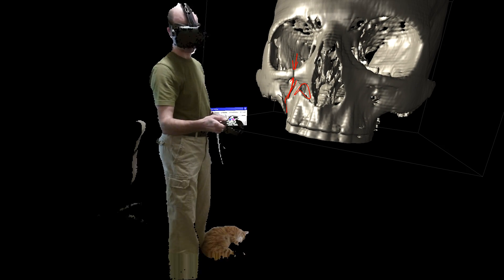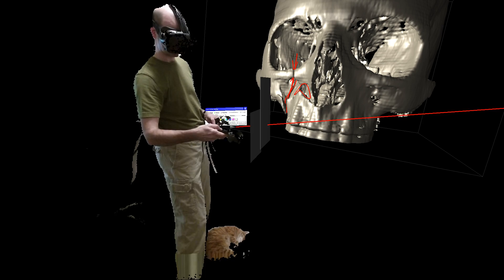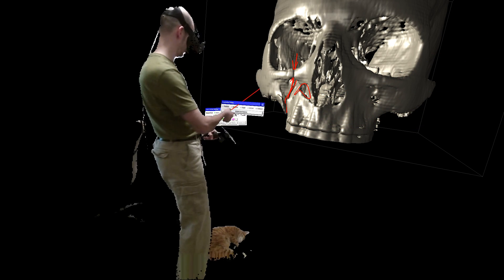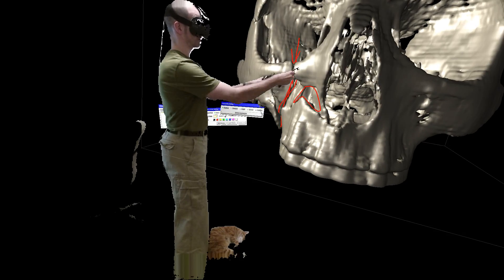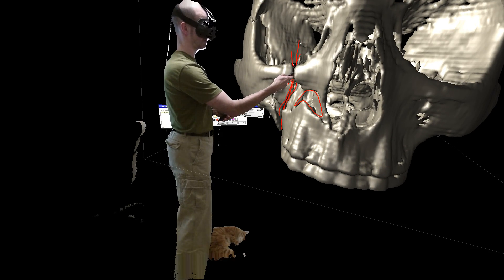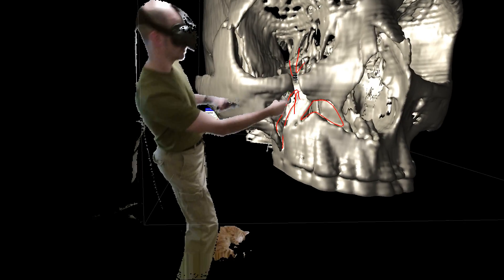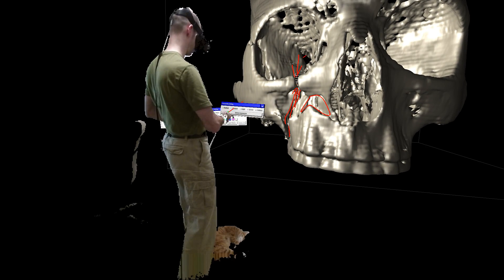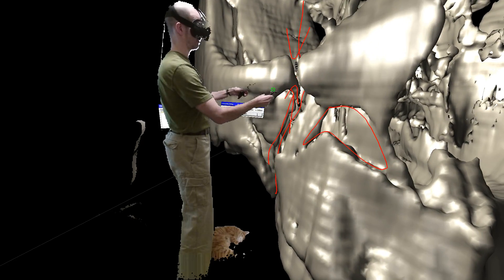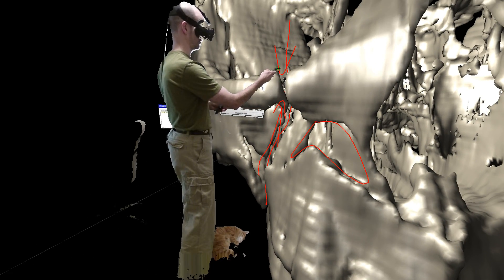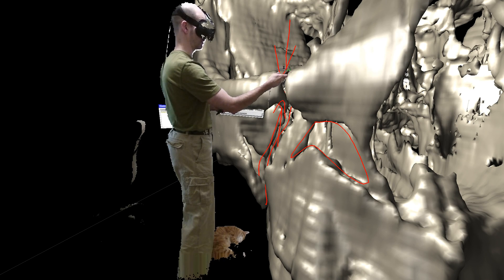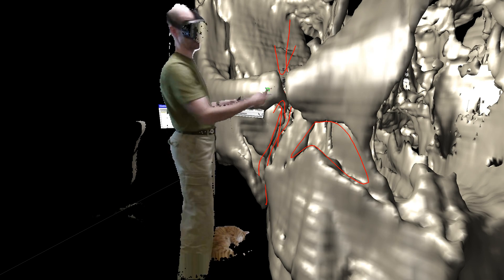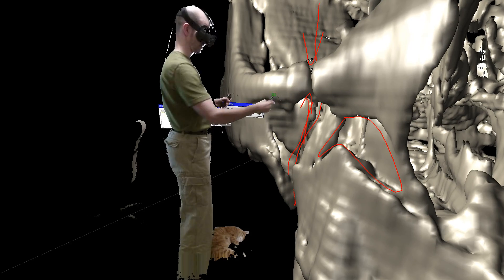We can measure the exact displacement. I can use an annotation tool right here to measure the 3D position of this particular fracture by just putting a measurement marker right in there. I don't know if you can see that, that's the 3D position of that point, but I can also measure the displacement across that fracture by putting a measurement point on here, putting one on here and putting one on here. And we are getting the displacement to equal 5.3 millimeters, which is pretty significant.